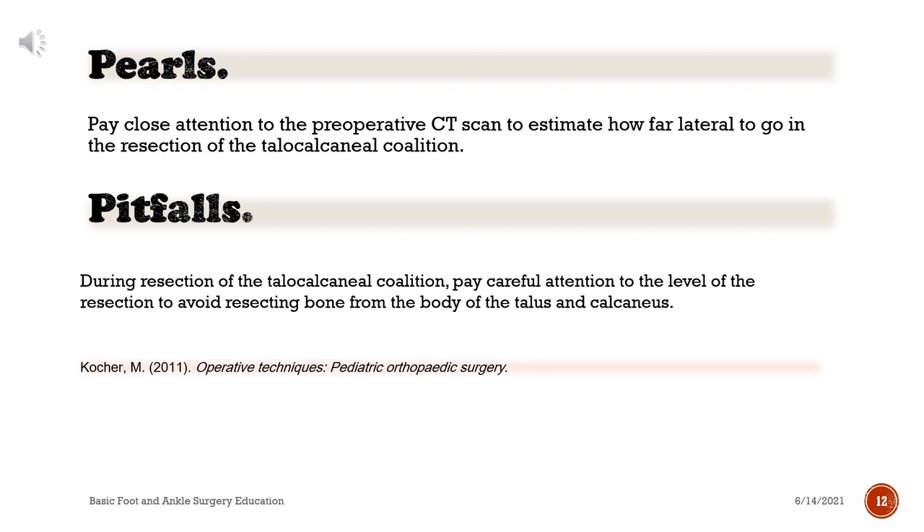Pearls: pay close attention to the preoperative CT scan to estimate how far lateral to go in the resection of the talocalcaneal coalition. Pitfalls: during resection of the talocalcaneal coalition, pay careful attention to the level of the resection to avoid resecting bone from the body of the talus and calcaneus.